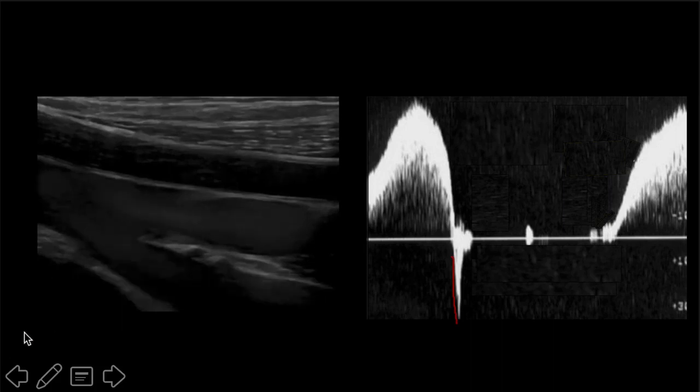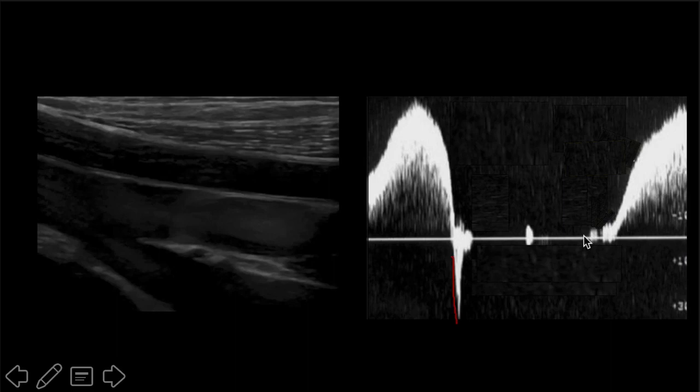It happens because of these things, right here. See, that is the valve. So valves are normal, and they work to prevent backflow. You get this initial jet from pressure, and then the valve kicks in and stops that backwards flow.